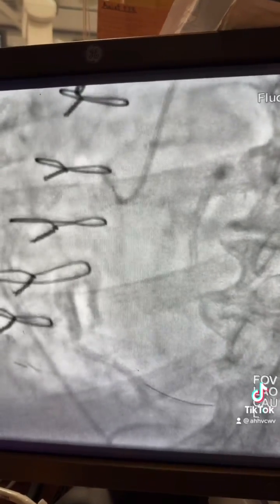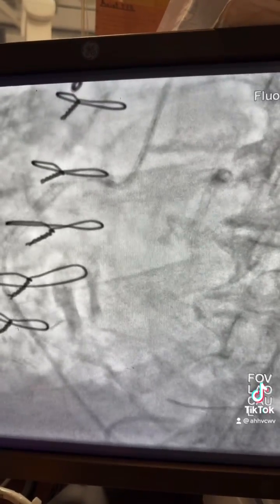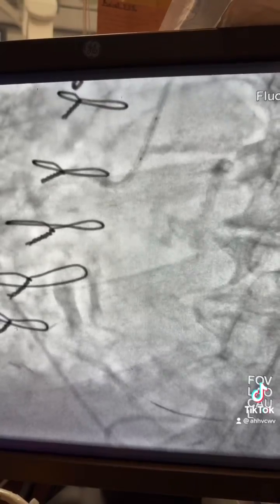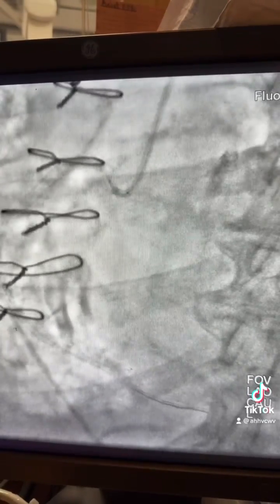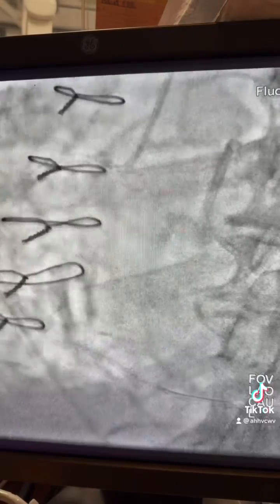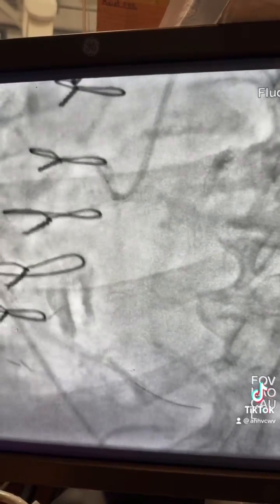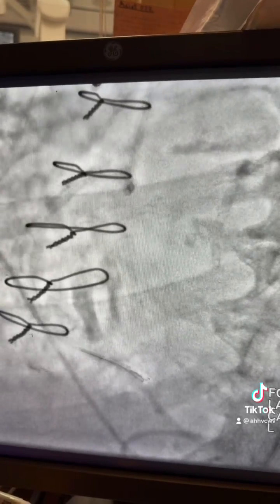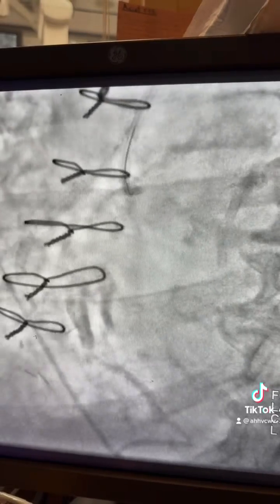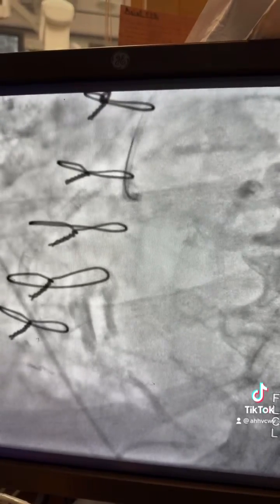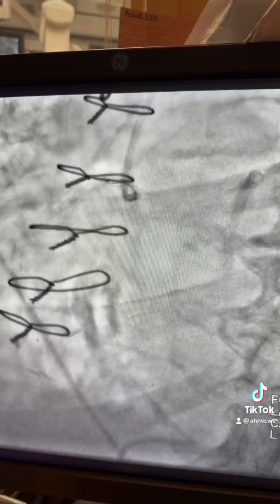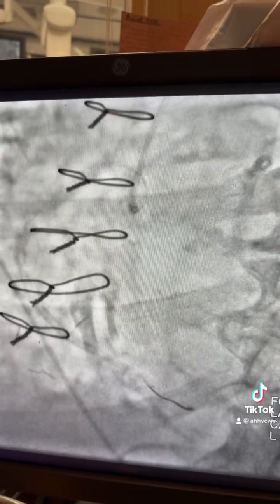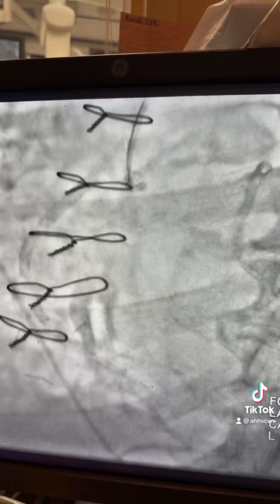Please do not fight it. Rethink, pull the wire, and make sure it's not going through the struts. As you see here, put on the wire, redirect the guide, and try a different route.